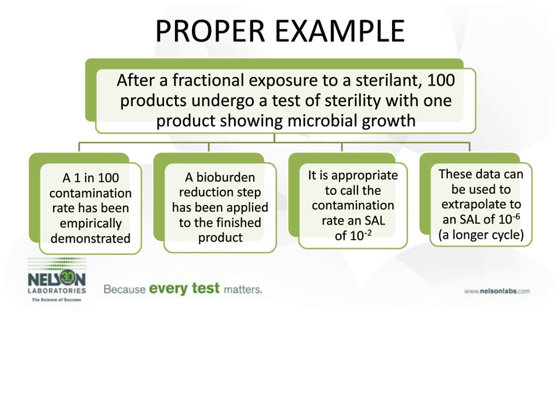And also, since it's appropriate to call it an SAL, then these data can also be used to extrapolate or to determine a cycle that would be an SAL of 10 to the minus 6, which is always a longer cycle, longer exposure.